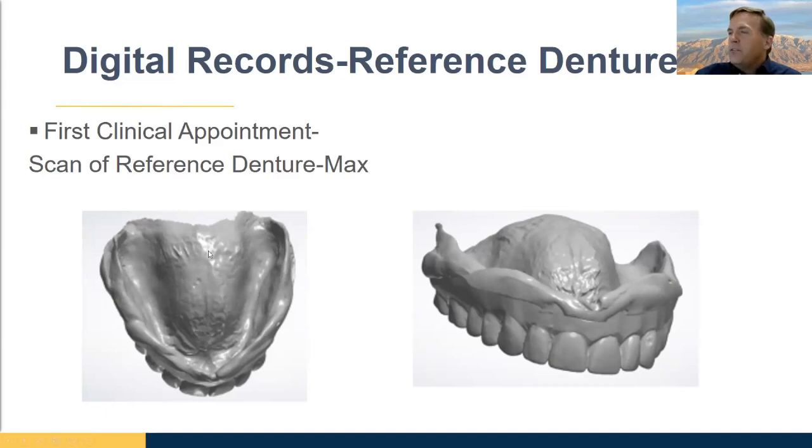What you want to do is start on the intaglio surface, like on a maxillary, start in the middle here and then scan out, out, out in bigger circles. Then as you get out towards the edge, deliberately roll over the edge to try to capture some of that cameo surface. Once you've done that, you can flip over and find a big area of cameo you already have and build the external surface of your scan that way.